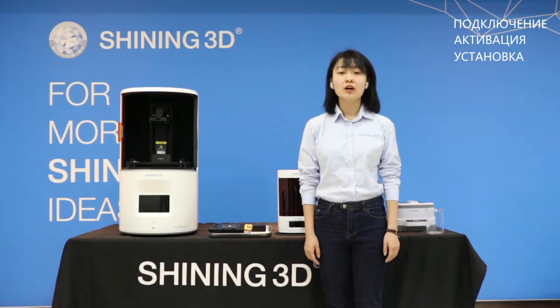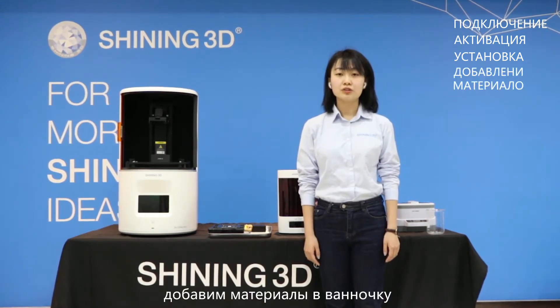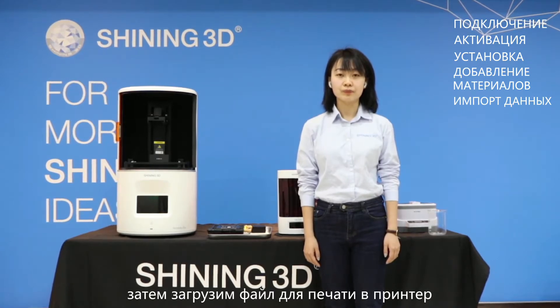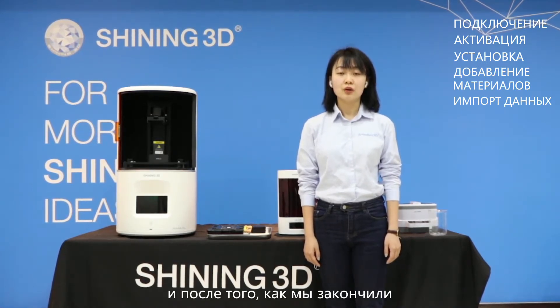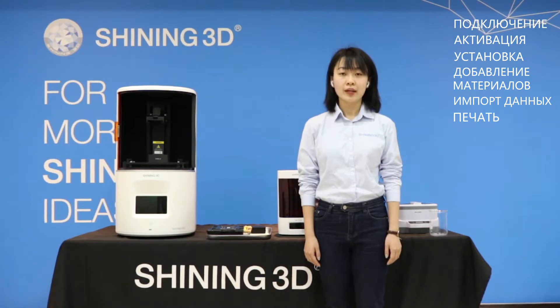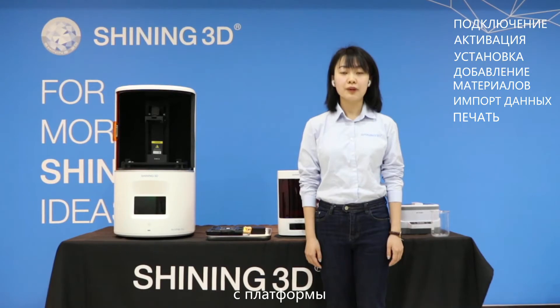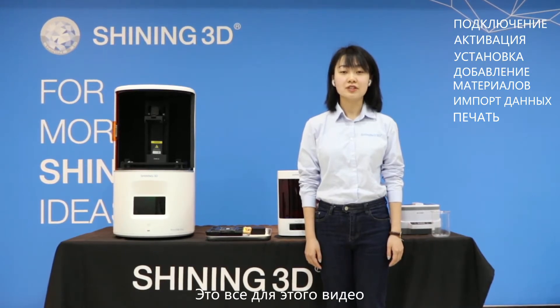On the third part we will add some material into the resin tank and then load the printing file into the machine. After we finish that we will be ready for the printing, and after the printing finishes we will take off the printing part from the build platform. And that is what this video covers.